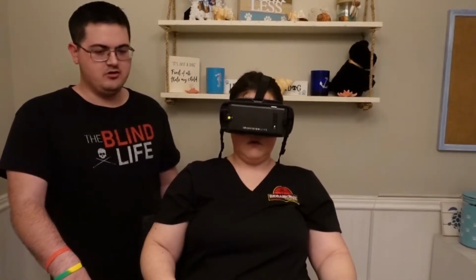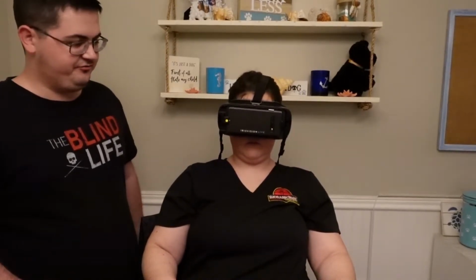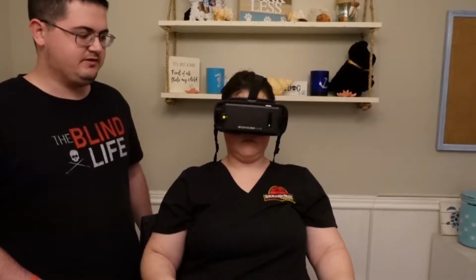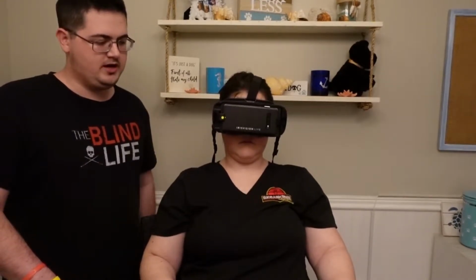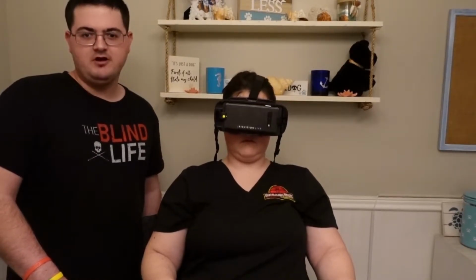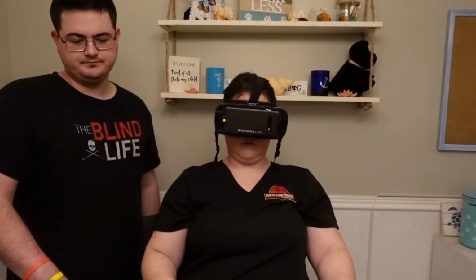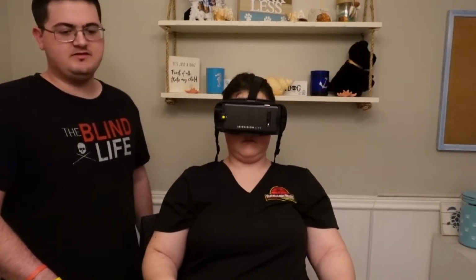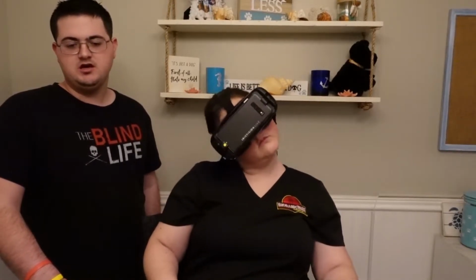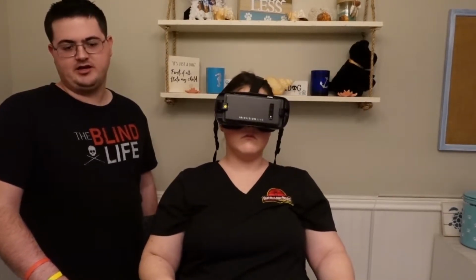So this is most likely going to be something you use a lot if you have the IrisVision Live. However, it's important to remember that this doesn't have the longest battery, and it does recommend, if you're going to use a computer screen or watch a TV, that you use the charger that it comes with, which is a magnetic charger. Yes, so it goes in magnetically. They do recommend that if you're going to do something for a long period of time like TV and a computer, make sure that you're using the magnetic charger.